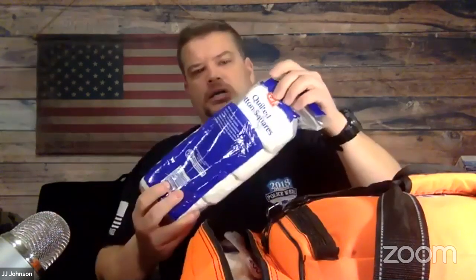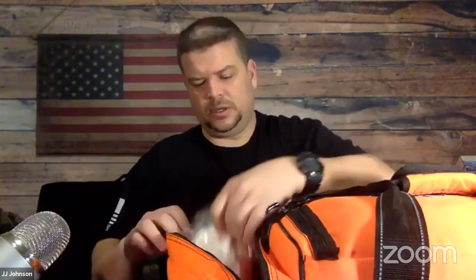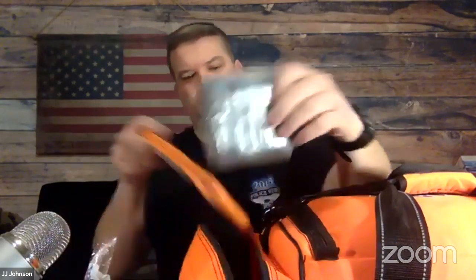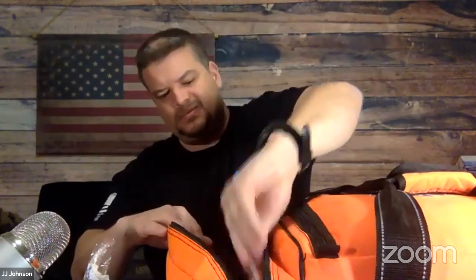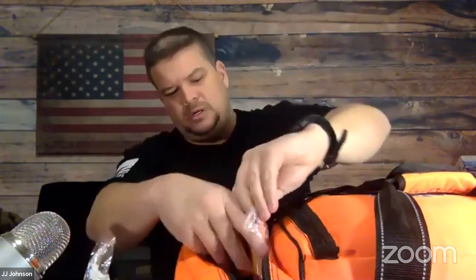Got some just cotton squares and some cotton balls, a roll of TP, and then two splints, two SAM splints, and then one little finger splint. It's just a little foam finger splint. Okay, let's put this back in.